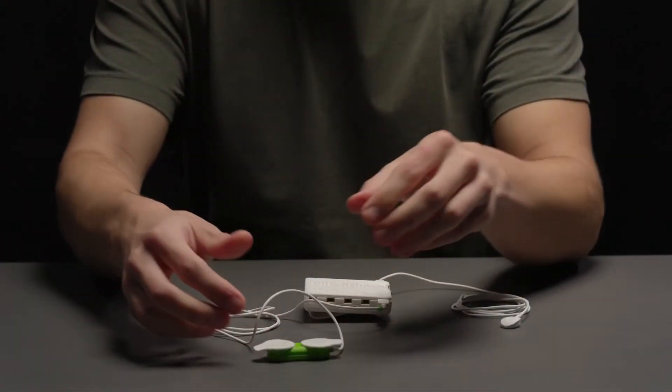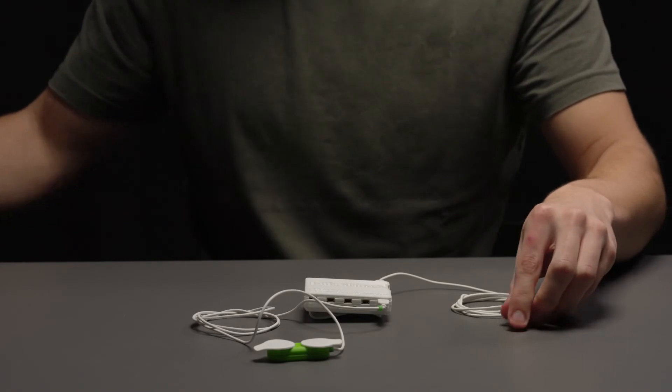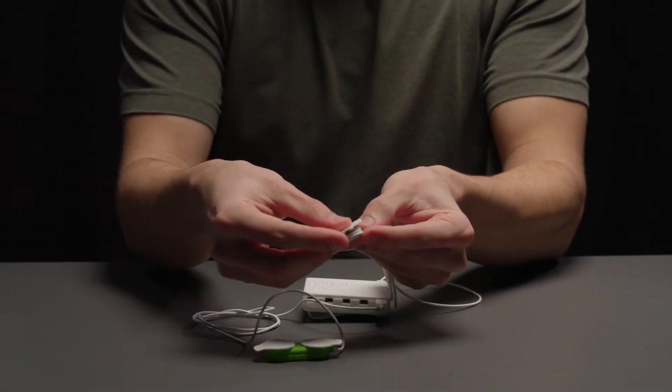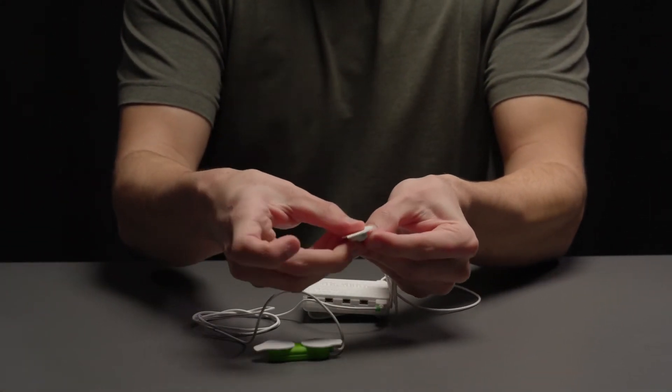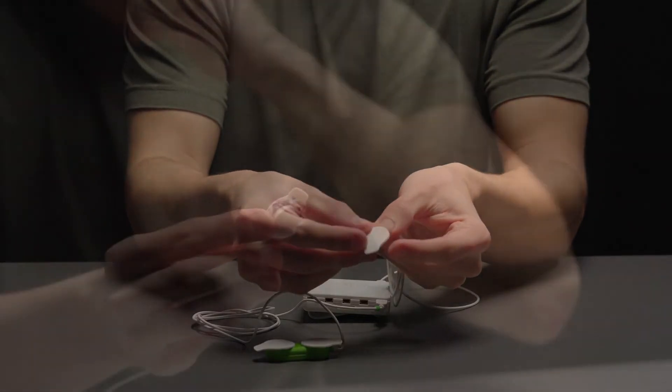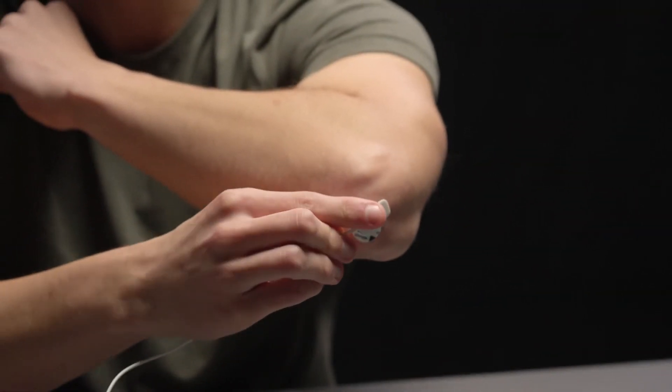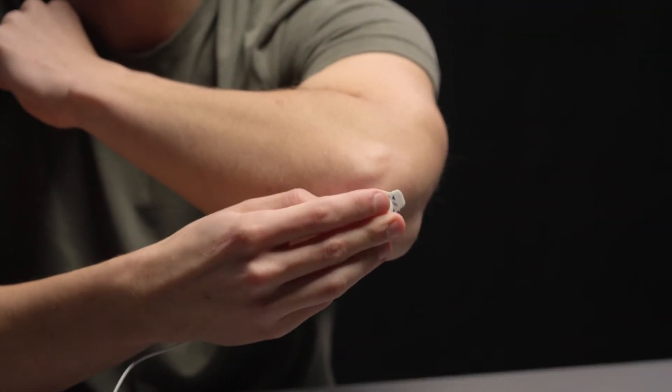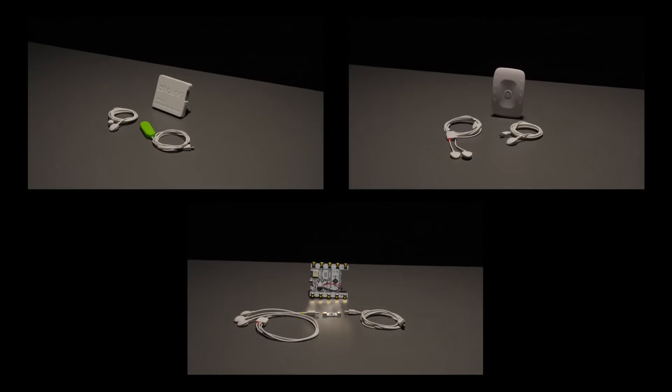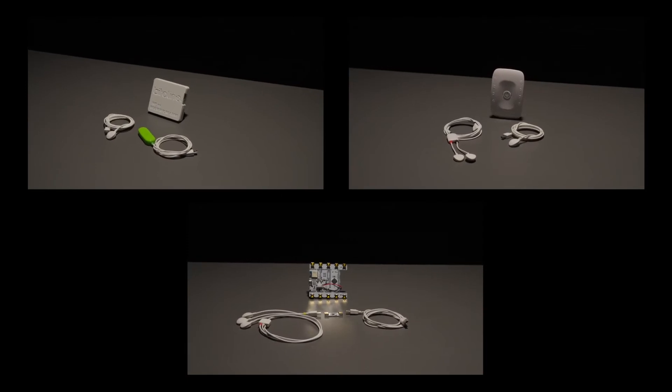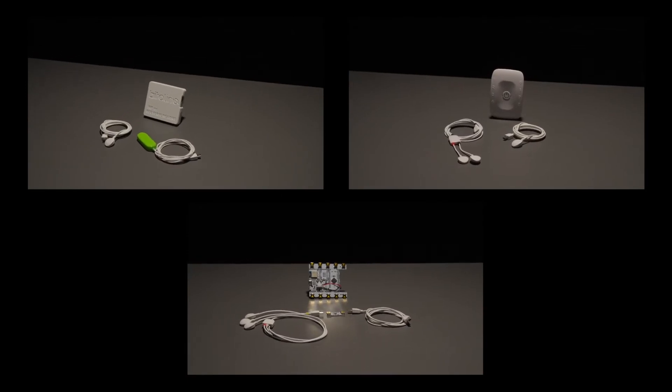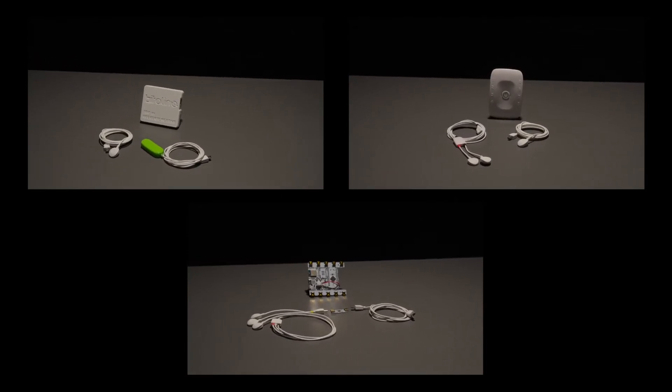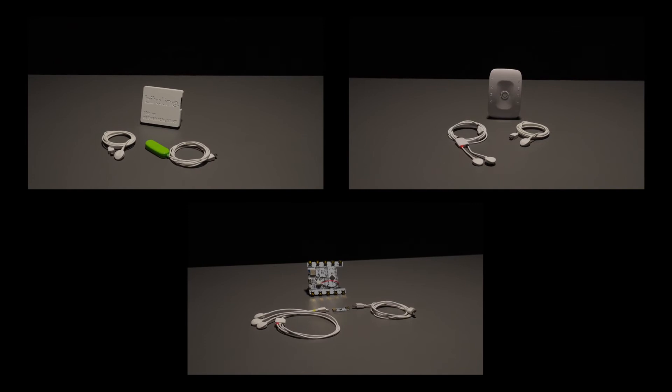The last step is the position of the reference electrode. It must be placed on a neutral area, such as a bone. Let's place it on my elbow. Repeat with all three options from top. Done! Now you can start your acquisition.